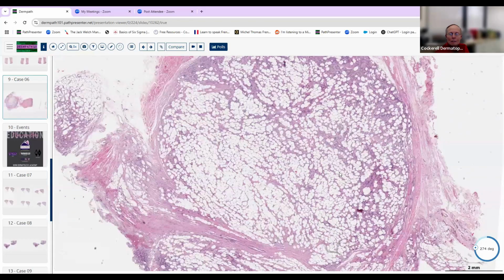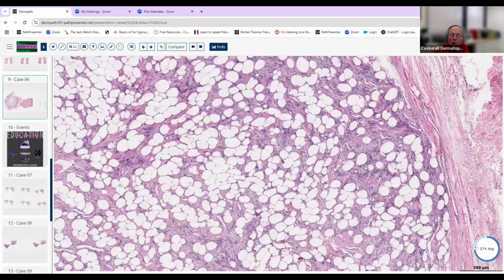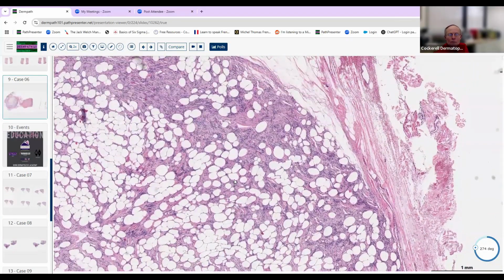And so when you are going to look to see what other type of lipoma you're looking at, if these are blood vessels and they have little lobular capillary proliferations, and we saw the case of the thrombotic vasculopathy a second ago where the blood vessels were sludged with red cells. They're not really the same kind of sludging of red cells we saw in that lesion within an angiolipoma, but there are almost always a lot of intact red blood cells in the vascular spaces of an angiolipoma. We have some vascular spaces here. They're small capillaries. We don't really see those little tufted blood vessels that we see with an angiolipoma. So we don't like angiolipoma here.